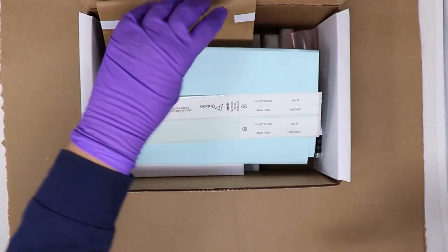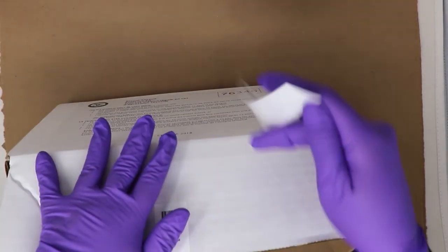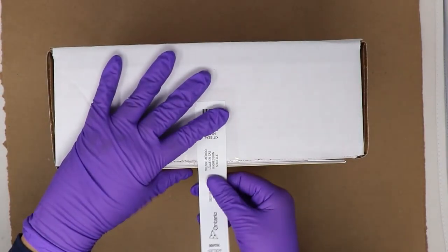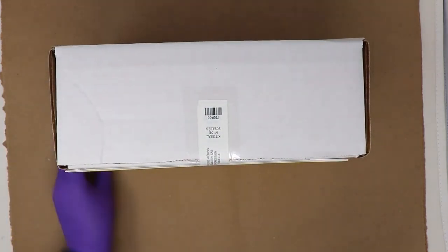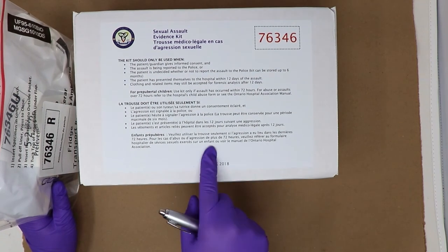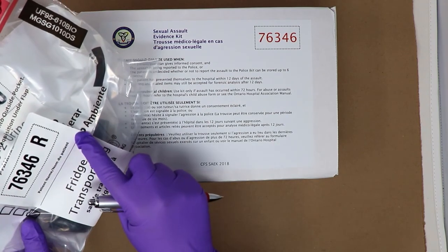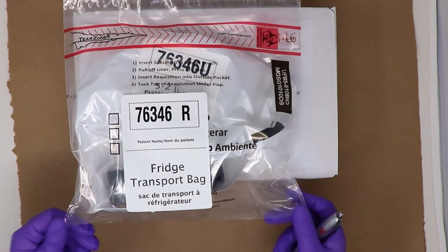One should be placed back into the box for future use, and the other seal used to seal the outside of the core kit box. Once the seal has been applied to the outside of the box, it should be initialed. There are 3 different types of storage that may be required for a complete kit. The core kit itself can be stored at room temperature. The fridge transport bag should be placed into a refrigerator to keep the blood and urine cold, and anything that requires freezing should be placed inside the freezer transport bag and stored accordingly.